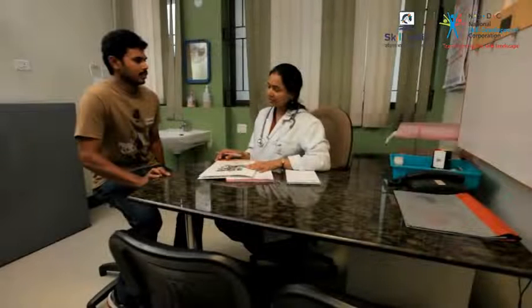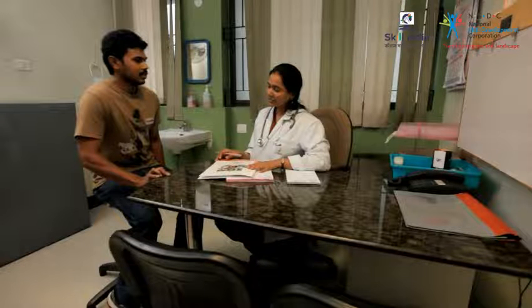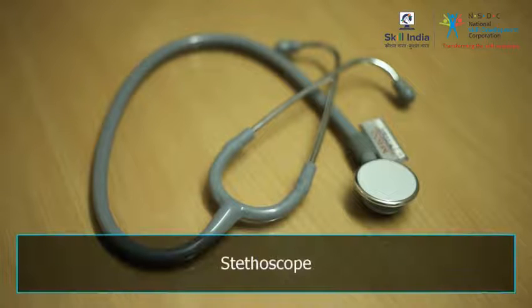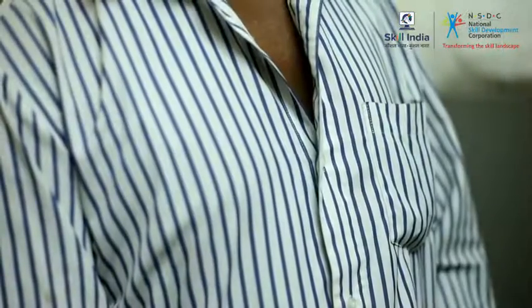Common medical equipment. You need to identify and understand the form and function of some hospital equipment in order to assist the doctor or the nurse efficiently. Let us now look at the common medical equipment used. A stethoscope is used for listening to the sounds generated inside the body.